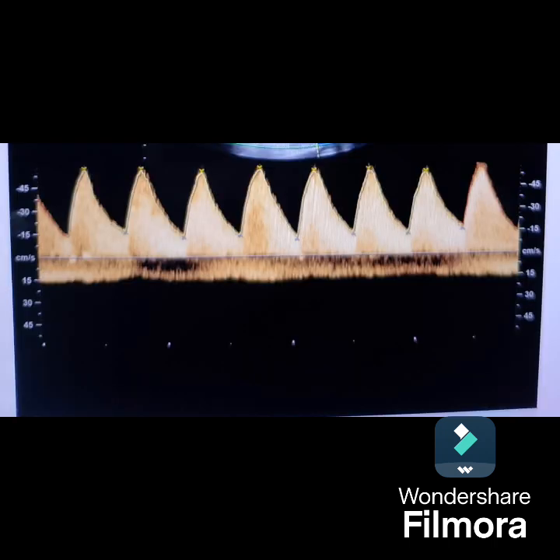Now what is the flow chart for management of IUGR depending upon Doppler? Suppose the Doppler velocity is normal, pulsatile index and other things are normal, only IUGR, then you deliver it at 37 weeks. You do routine monitoring, with Doppler once in 15 days, and it will be delivered at 37 weeks.